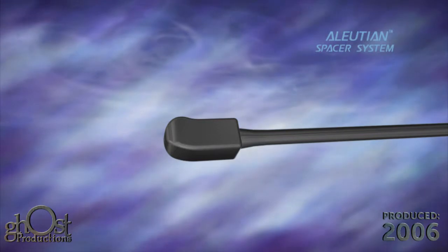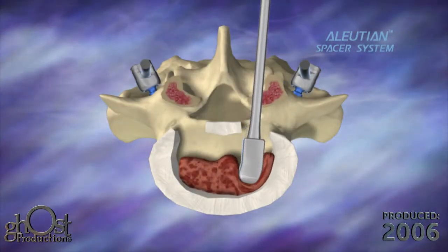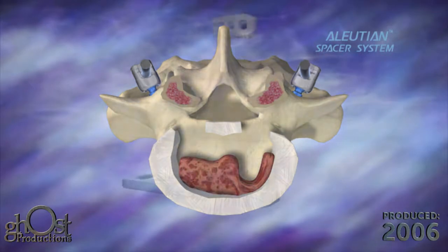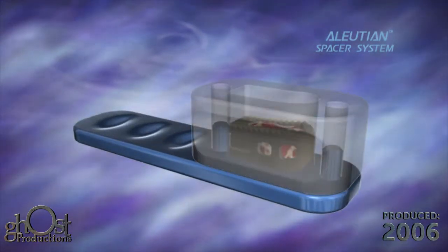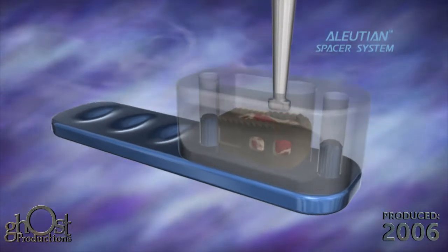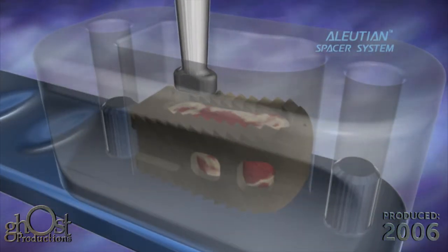Implant trials are included to aid in initial test fitting and size confirmation of the implant. The appropriate size spacer is chosen at the discretion of the surgeon, based on the trial height. The surgeon or staff may utilize the bone packing mold to aid in placement of the appropriate bone graft and/or osteobiologic. The packing tamp may be used as final prep of the bone graft material in the implant.